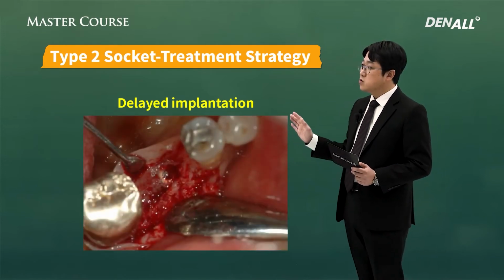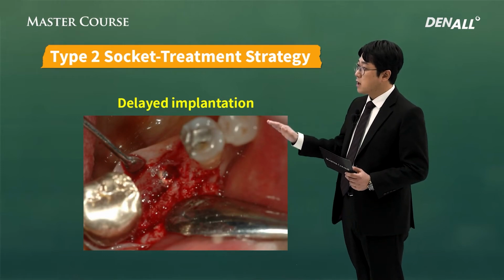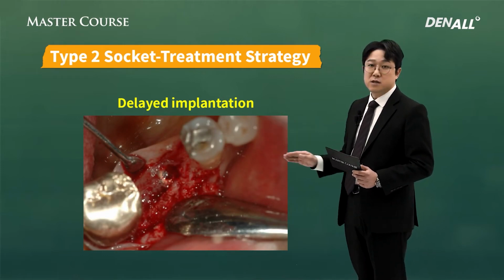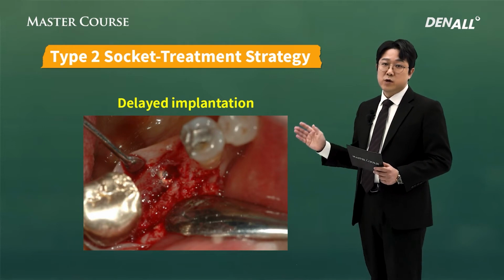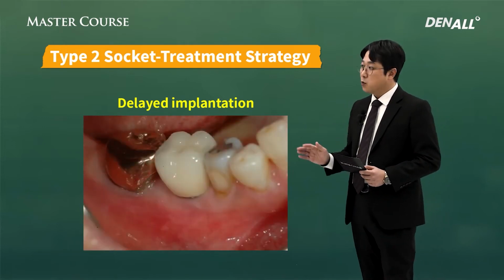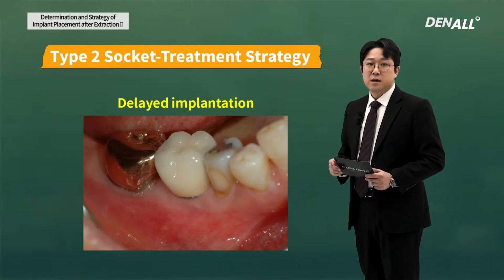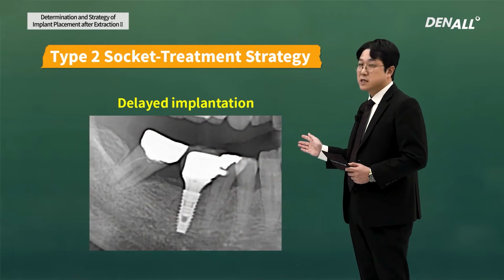4 months later, at secondary surgery, you can see that the buccal bone, which was severely resorbed, there's a lot of bone regenerated, and you can see that the buccal bone has been regenerated after treatment. This is the patient's mouth. Panoramic image.